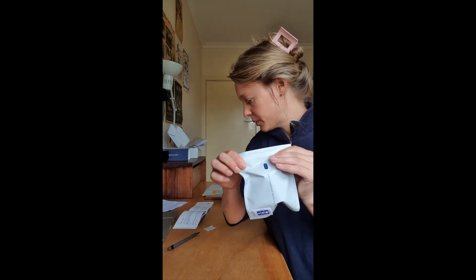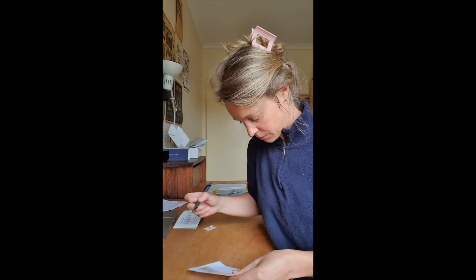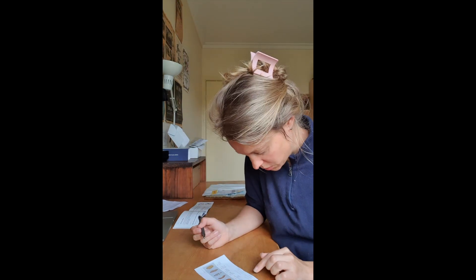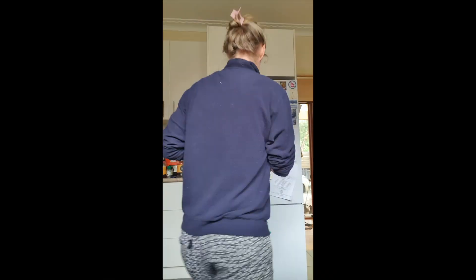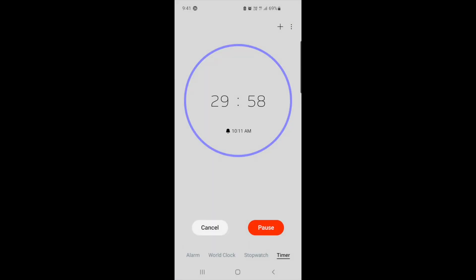Next step, you need to fill out the Bristol stool chart — grab that, fill it out, get that done. Then take your large pouch with the pot and the blue-capped lid and pop it in the fridge for a minimum of 30 minutes. I actually set a timer.